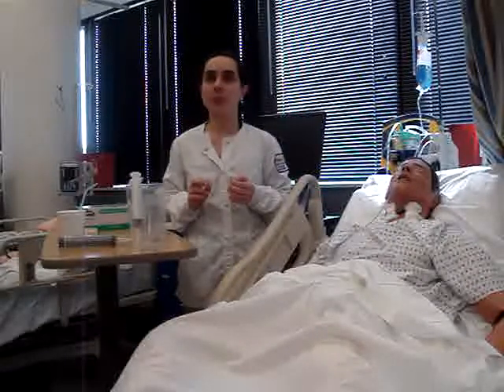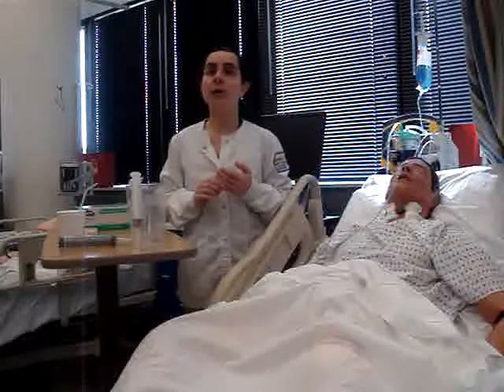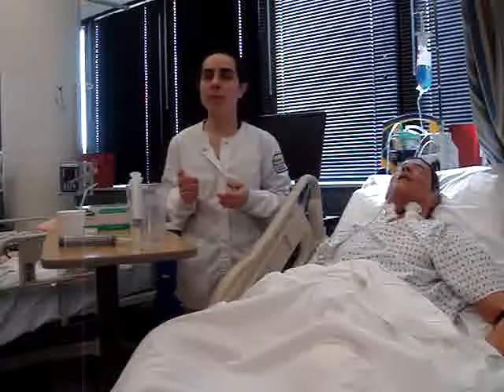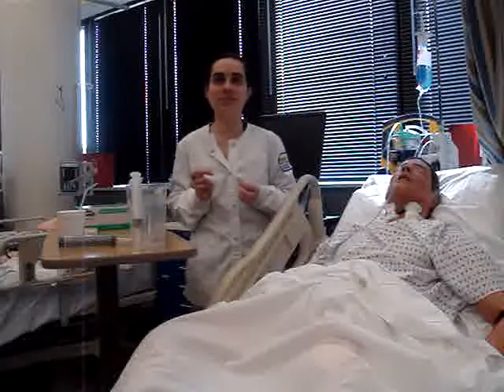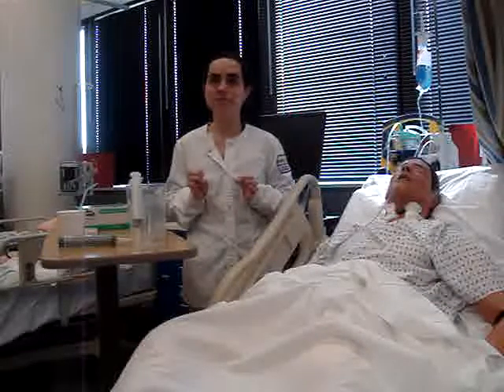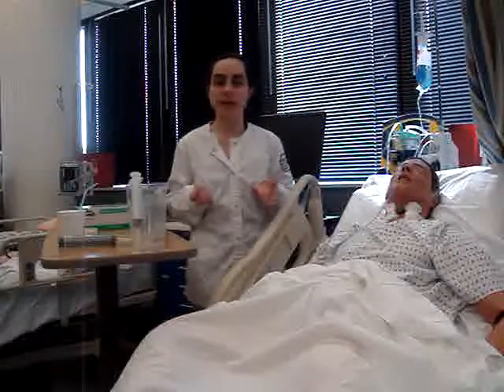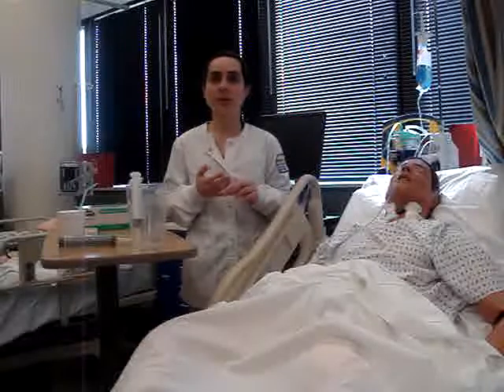And also I'm going to prepare the feeding setup. I'll check the expiration date of the formula again. I will cleanse the top of the feeding container before I open it with an alcohol gauze. I'll pour into the feeding bag, I'll prime the tubing, and I'll clamp the tubing. After this, I will attach the feeding setup to my feeding tube. I'll set the prescribed rate that I'm going to use for the feeding, and I'll unclamp the tube.